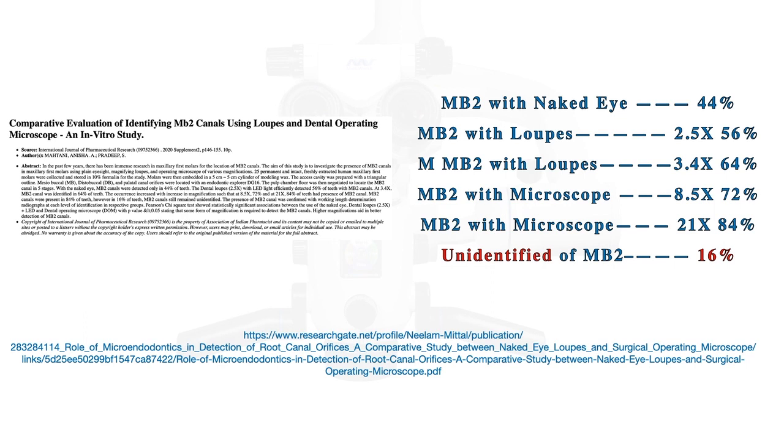it is true, because some dentists attend my basic and advanced courses. In the basic course, I tell them that using magnification is very important, and in the advanced one they work with the dental operating microscope, while in the basic one I tell them it's their option to use a microscope or a dental loupe. So in the next course, one said, Doctor, thank you very much for your recommendation. Today I find more MB2 in my cases. I know why: because we are using magnification.